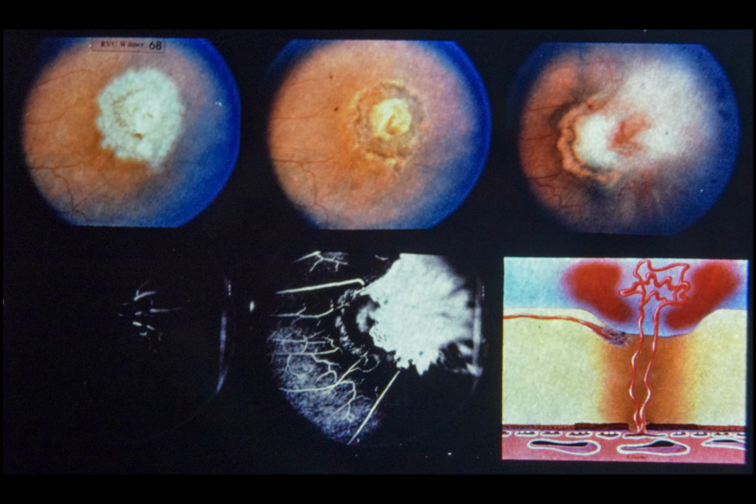Four months later, the patient complained of metamorphopsia, although visual acuity was still 20/20. Examination at that time, upper right, showed hemorrhage and intravitreal proliferation from the photocoagulation scar. Fluorescein angiography below shows that the neovascular frond emanates from the choroid and is in fact a choroidal vitreal neovascular membrane. This is shown in the artist's sketch, lower right.